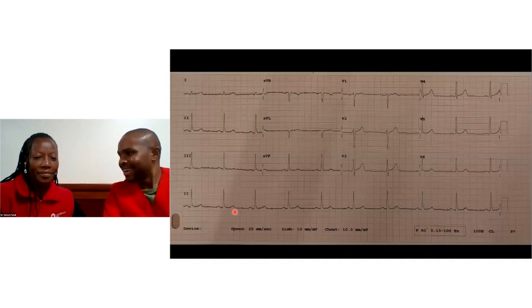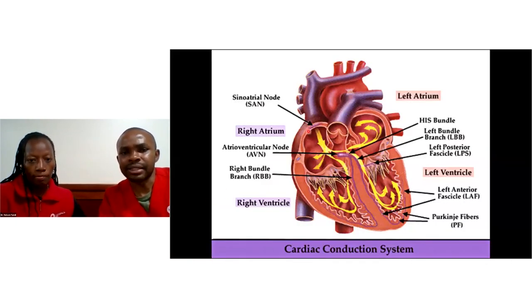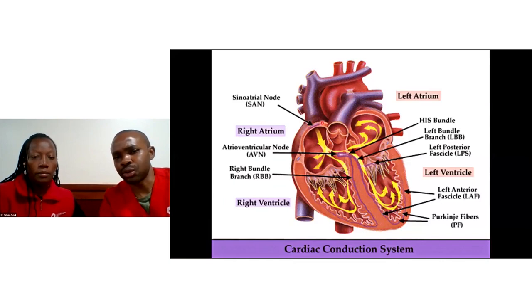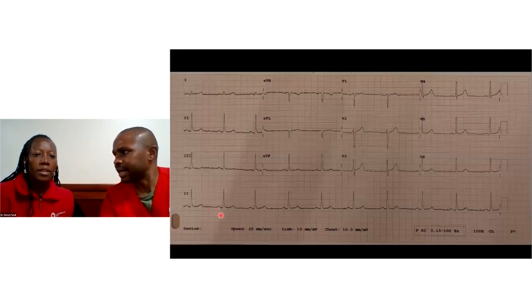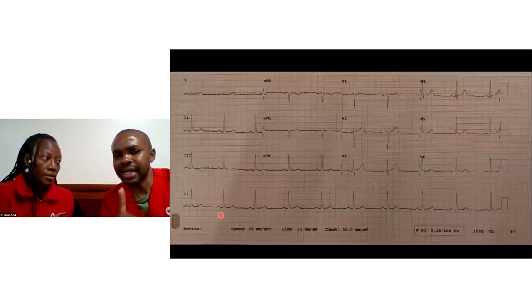And I think, maybe just to recap, we are saying that there is electrical activity inside the heart. And the first place in a normal heart where the impulse starts is from the sinoatrial node, which is right here in the atria. And when the impulse is generated, it's transmitted across the atria through what we call the internodal, the atrial pathways. And as it's going through the atria, am I right, Grace, that's what now gives us this P wave right here? That's very true, as the atria contracts.